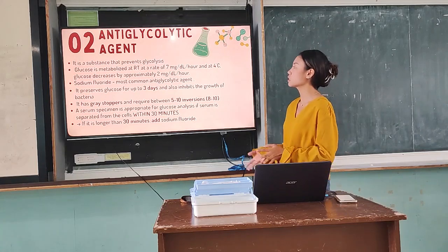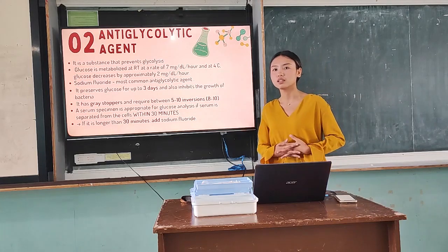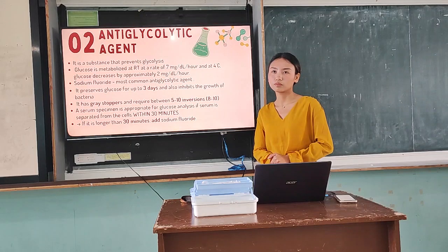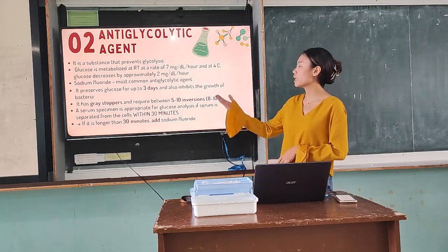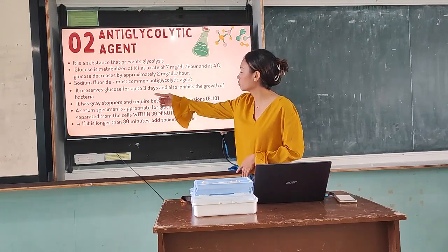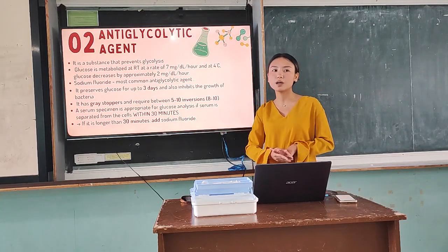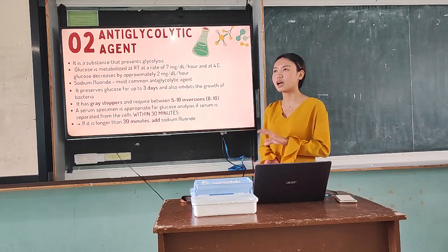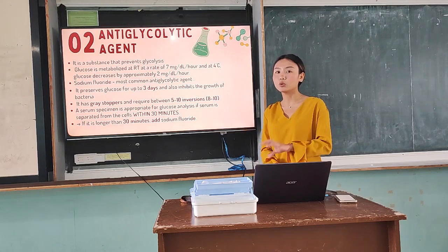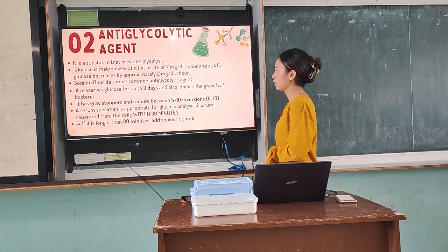Anti-glycolytic agent. So it is a substance that prevents glycolysis. When we say glycolysis class, ano nga ulit yun? Ma'am, glucose is broken down to produce energy. Yes. So yun, yung sinabi dito na pinaprevent niya yung glycolysis. Kasi dito, nakalagay, it preserves glucose for up to 3 days and also inhibits the growth of bacteria. Di ba, unlike sa ibang test kasi, kailangan na merong mga certain specimen at saka test na kailangan agad mo siyang matest. Whereas dito, kaya niya mag-preserve ng glucose for up to 3 days.